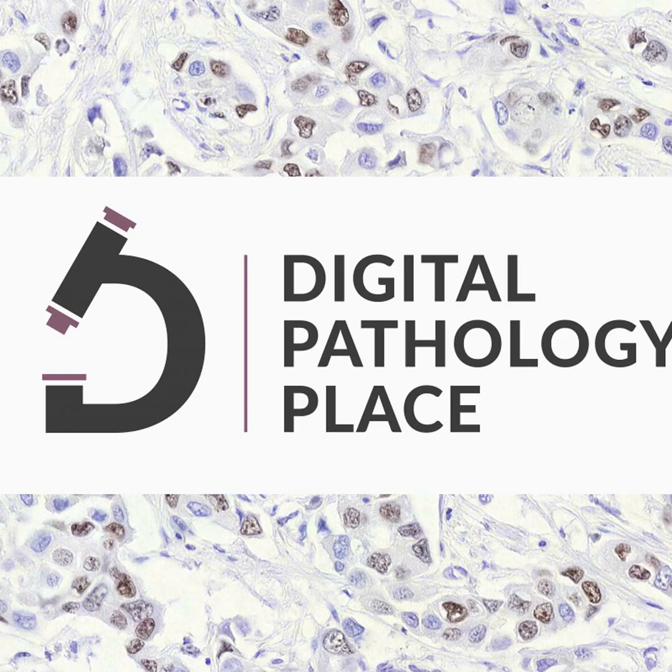However, it's essential to be aware that it isn't a one-size-fits-all solution. When addressing a problem that is not simply binary, for example, a question that extends beyond distinguishing a marker-positive cell from a marker-negative cell, the development of the model requires considerable planning and effort. You might need to build several image analysis algorithms that answer different binary questions in a sequence. Consequently, while tissue image analysis is an extraordinarily powerful tool in pathology, it comes with its set of limitations that users must understand and consider in their implementation plans.